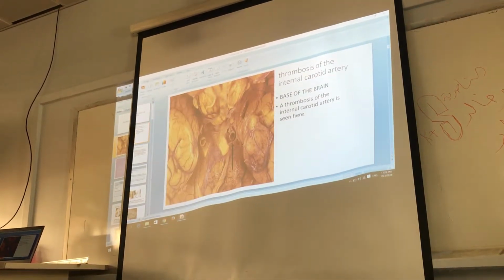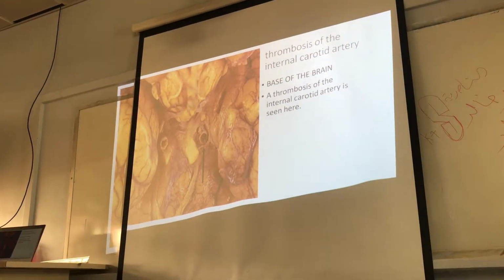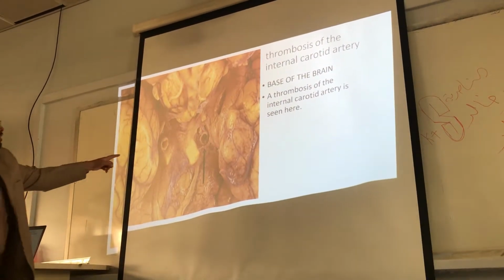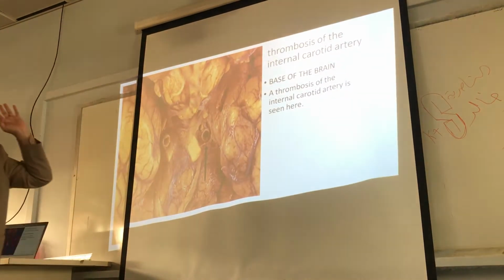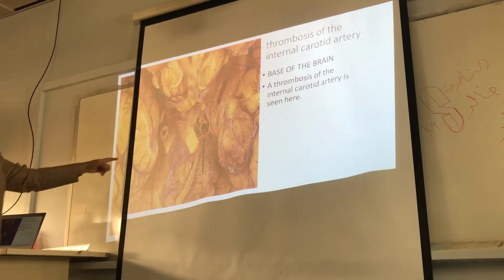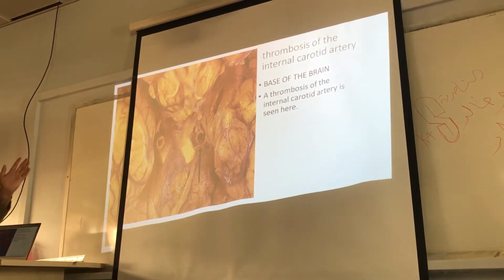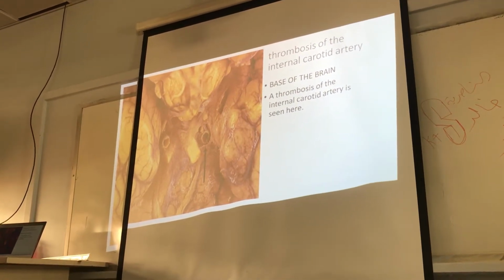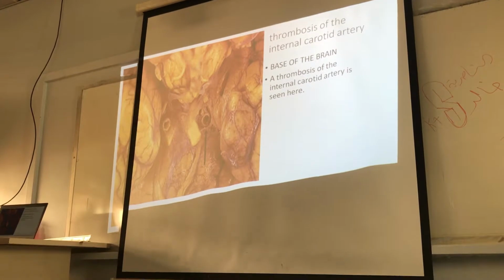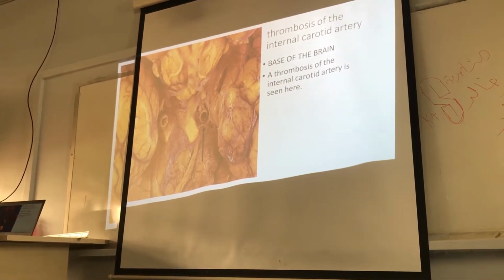Initial finding, Ali. What are you finding here? What is there in the lumen? Here, and here, the right one. Doctor, the left: is it empty or is there also thrombosis? No, empty. Only the right. Clear?